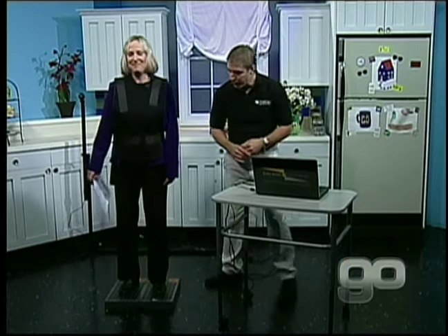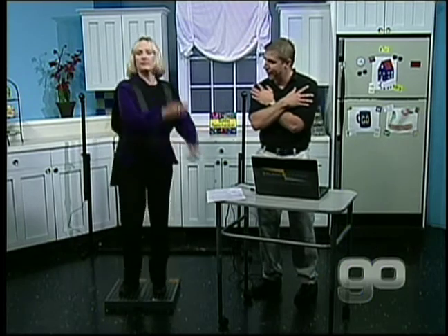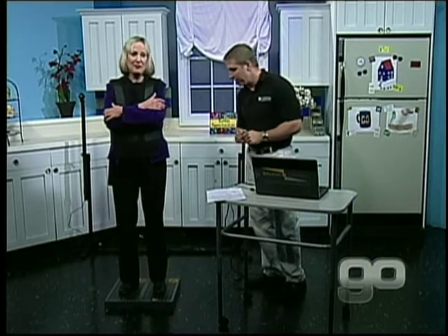Yes, I do. All right. What I'd like you to do for me first is go ahead and stand just like you are. That's perfect. Go ahead and cross your arms over your chest. Very nice. Now close your eyes. And we're going to hold that for 5 seconds. And very good. How does that feel? Fine. So far, so good. That's our baseline. I seem to have good balance.